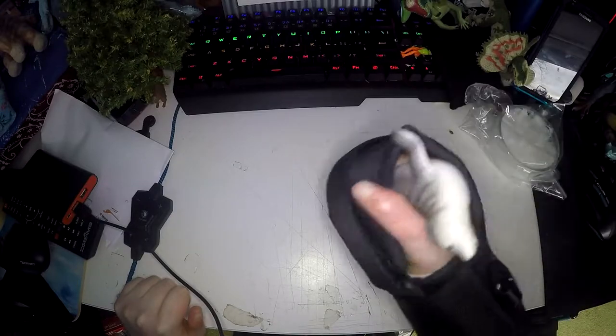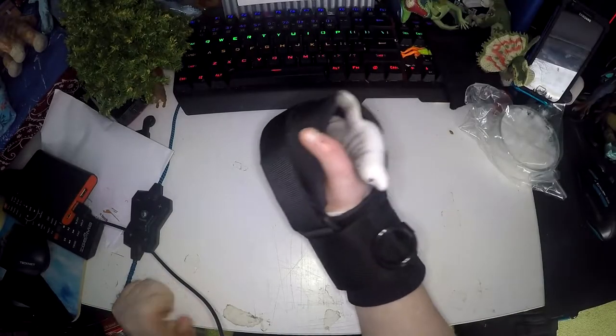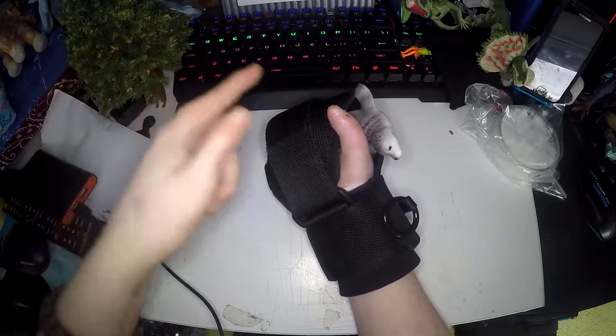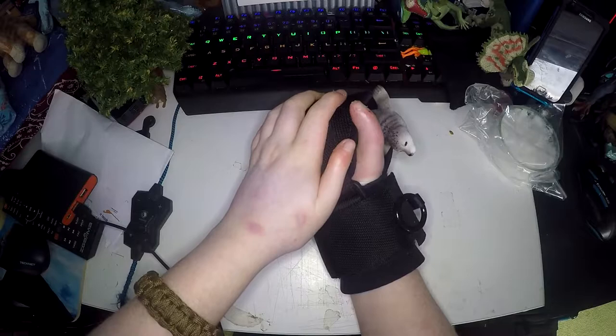The seal is not falling out and I have completely loosened my hand — the seal's not coming out. Your thumb sticks out of here, but like I said my thumbs are a bit unusual so it doesn't work perfectly, but it's still comfortable.